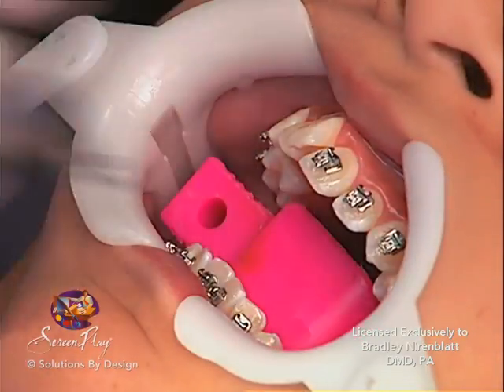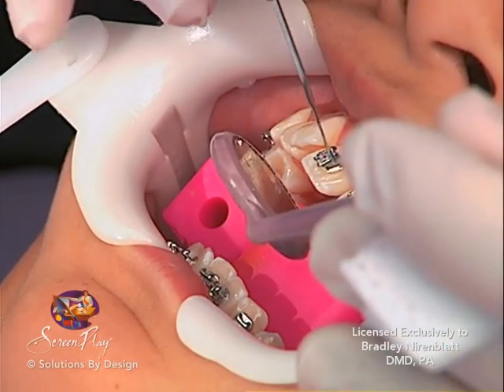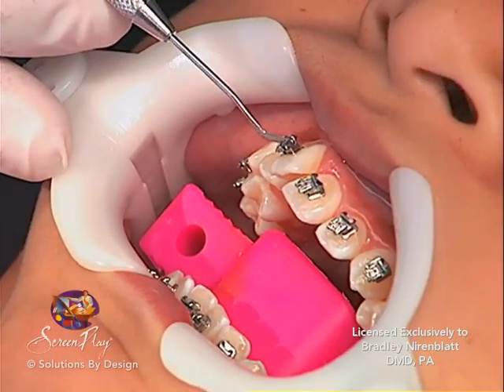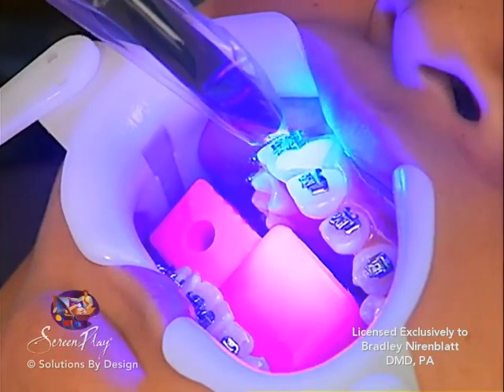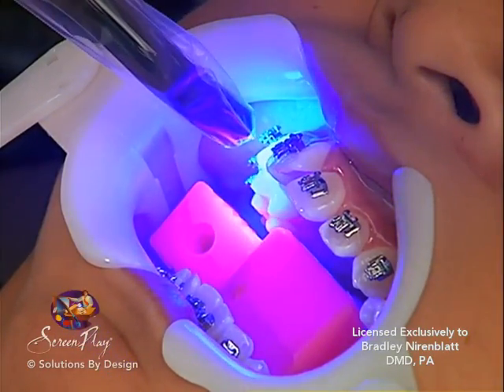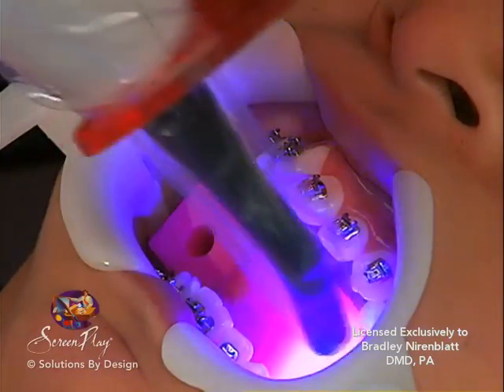Brackets are placed tooth by tooth in exacting position. Each can be measured to assure proper positioning. In most cases, the slot of the bracket is measured from the bottom edge of the tooth on each tooth. Next, a high-powered but safe curing light is utilized to activate and harden the adhesive to secure the bracket to the teeth. Some bracket types are pre-coated with the bonding agent already in place.